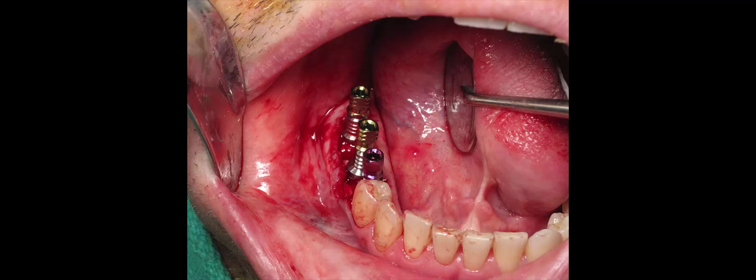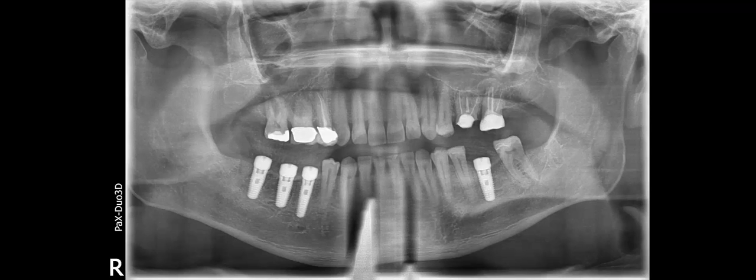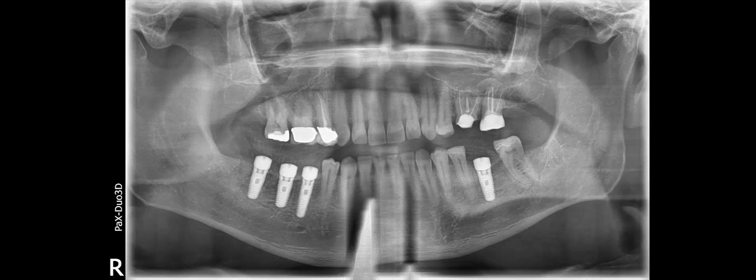Another view giving you an idea of the alignment which is very well placed by the 3D image guidance. The purple implant was placed at the same day that the tooth was extracted while the other two behind it were placed after the bone grafts have healed. So one's an immediate implant, the purple one, and two yellows are delayed placement.